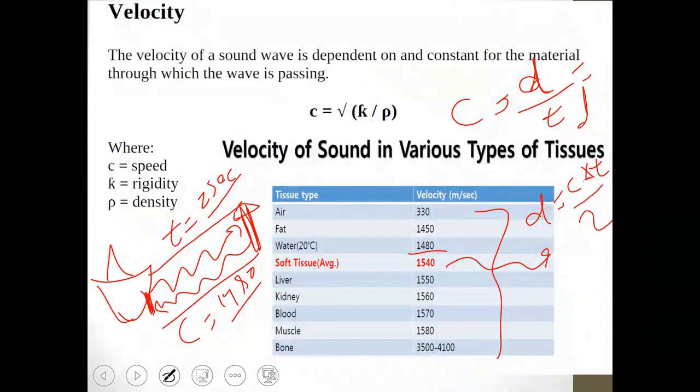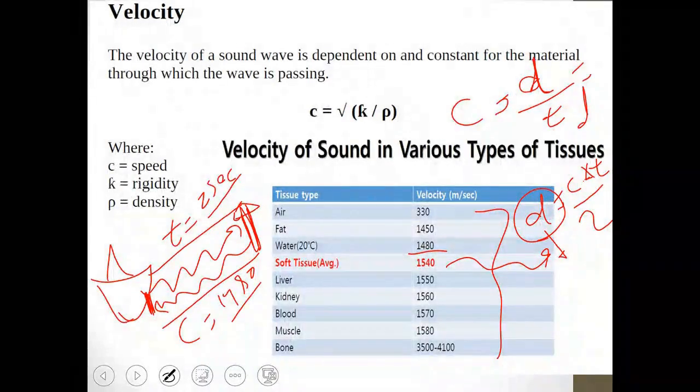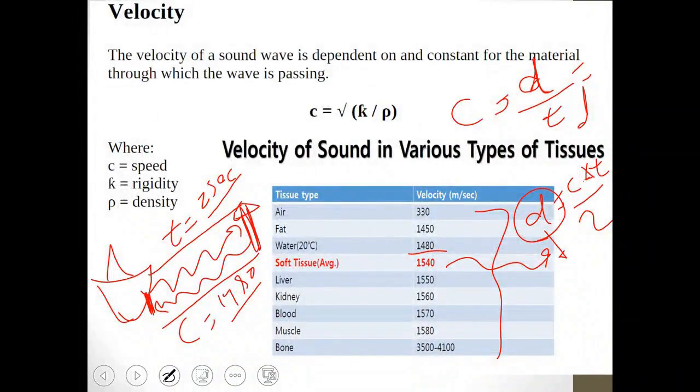This is the same idea, folks. The same idea in my probe when I send my pulse. I want to know where this pulse came from when it was reflected and returned to the probe. I want to know where it came from, any location. So it starts saying, I will send this specific pulse with this specific frequency at this specific time. Then it starts calculating, saying, well, now I know my field of view, or the cross-section I see of my sonar image. I want to determine the X and Y coordinates of where this signal is coming from.